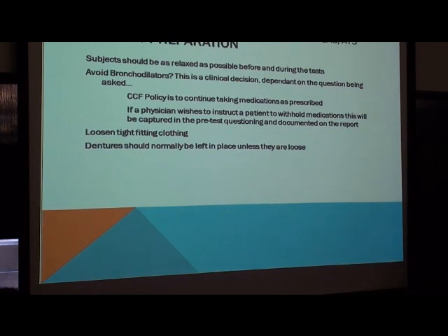Now, one of the things that we stopped doing here at the main campus a long time ago was asking patients to avoid the use of bronchodilators, to discontinue their medications. And when we used to do that, one of the things that we found was some patients really didn't tolerate that very well. I can recall several instances of patients phoning in to cancel their pulmonary function and doctor visits because they ended up in the ED the night before trying to comply with the instructions to withhold all inhaled bronchodilators, and at that time oral bronchodilators as well. And so at that time we said, you know, this really doesn't make sense.